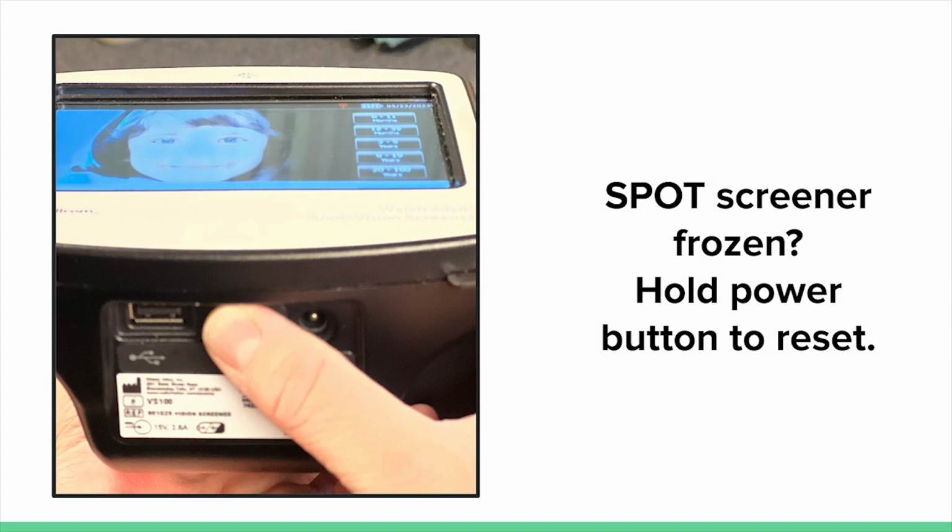If the Spot screener freezes or the touchscreen no longer responds, you can reset the machine by holding the power button at the base of the machine for several seconds. This should automatically force the machine to reset and restart.